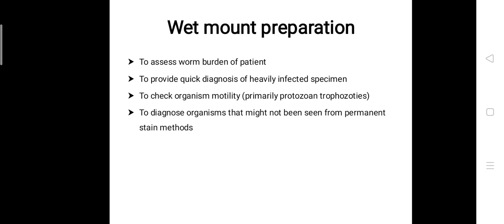Gastrointestinal infection by parasite pathogens or helminths is primarily diagnosed by detecting the live motile trophozoites for protozoa, cysts for the inactive dormant stage of protozoa, or eggs in case of helminths in stool.